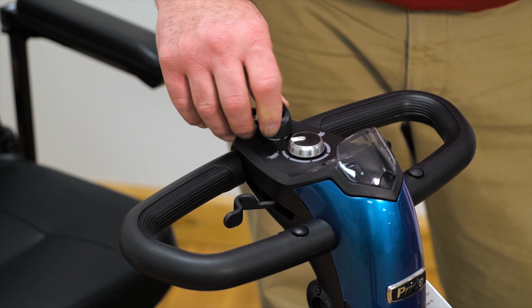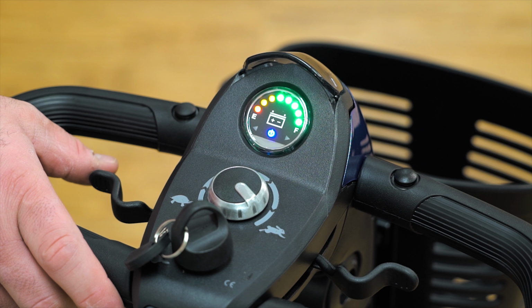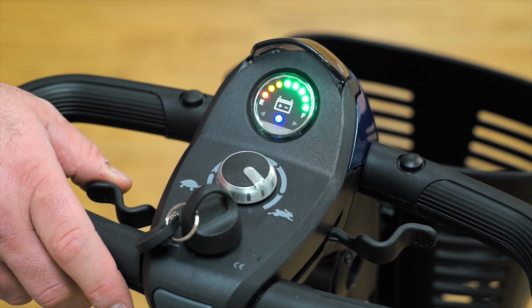Take the key from the owner's packet and place it in the key switch and turn on the scooter to test and make sure the scooter works properly.